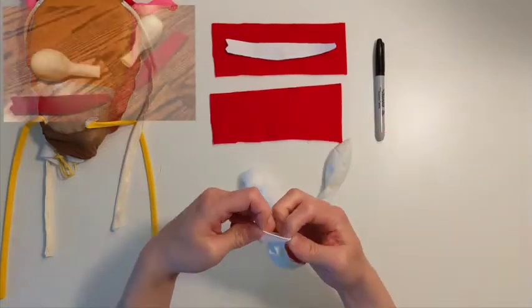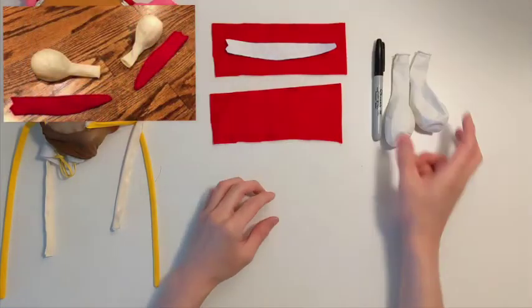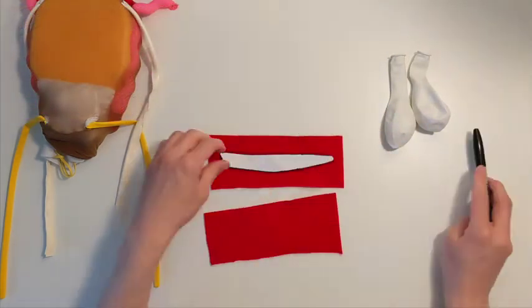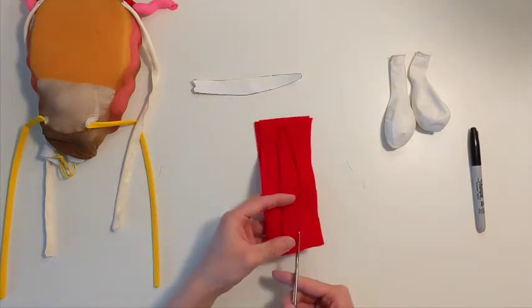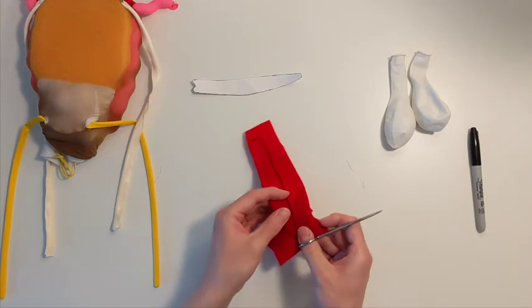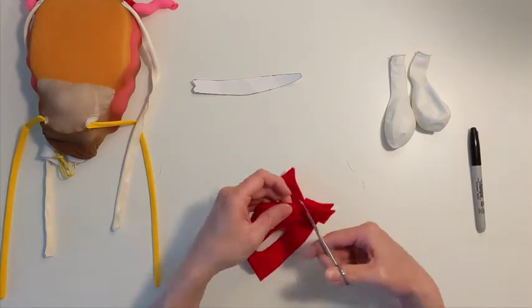The final pieces to make are the fallopian tubes and ovaries. For the ovaries, roll a white 9 or 12-inch balloon inside out and grab a cotton ball with the inside of the balloon. Then roll the balloon back. Repeat for the other ovary. For the fallopian tubes, use a 2.5 by 16 centimeters stencil to cut them out of red felt.